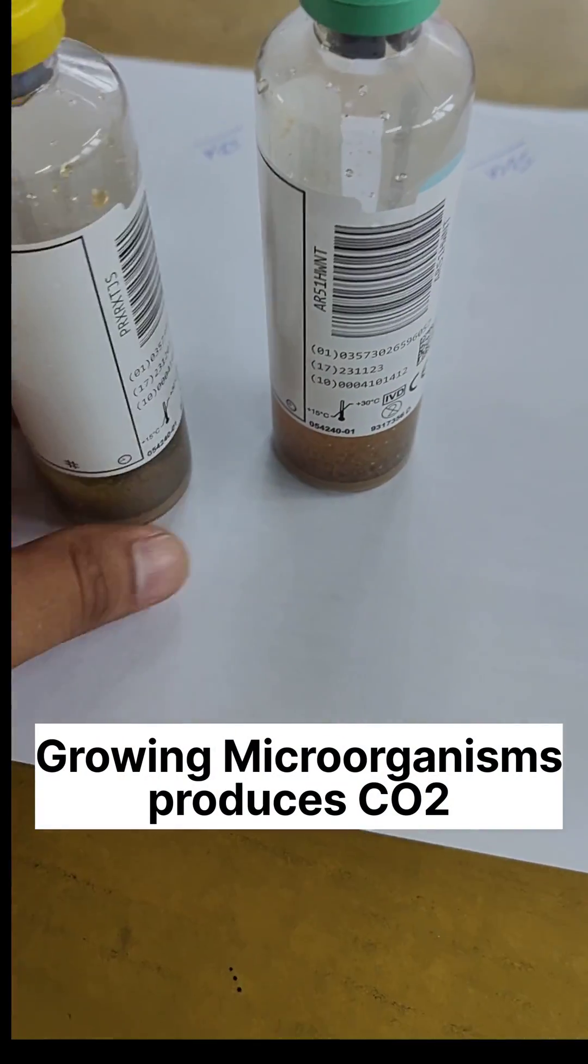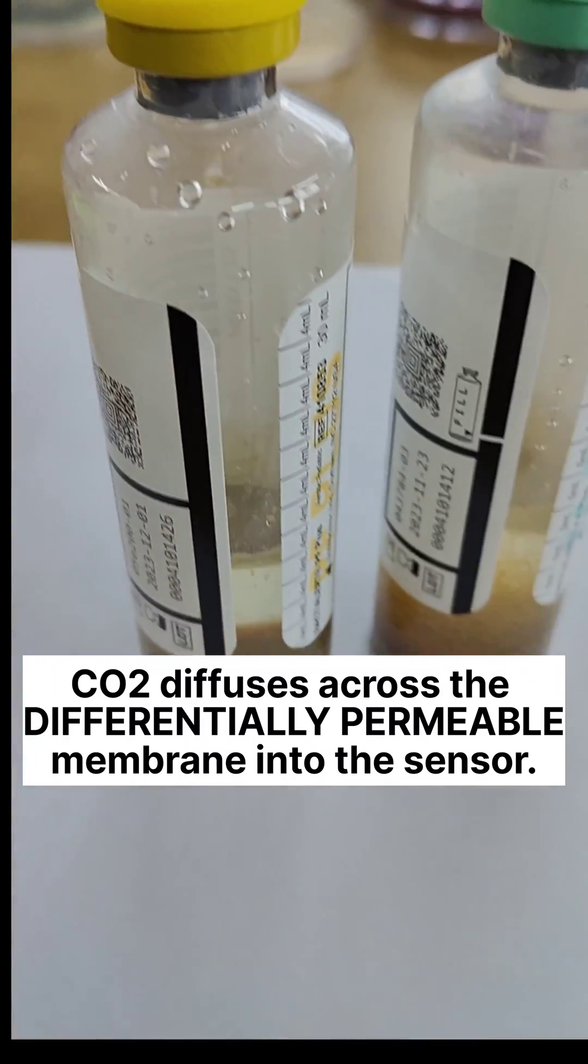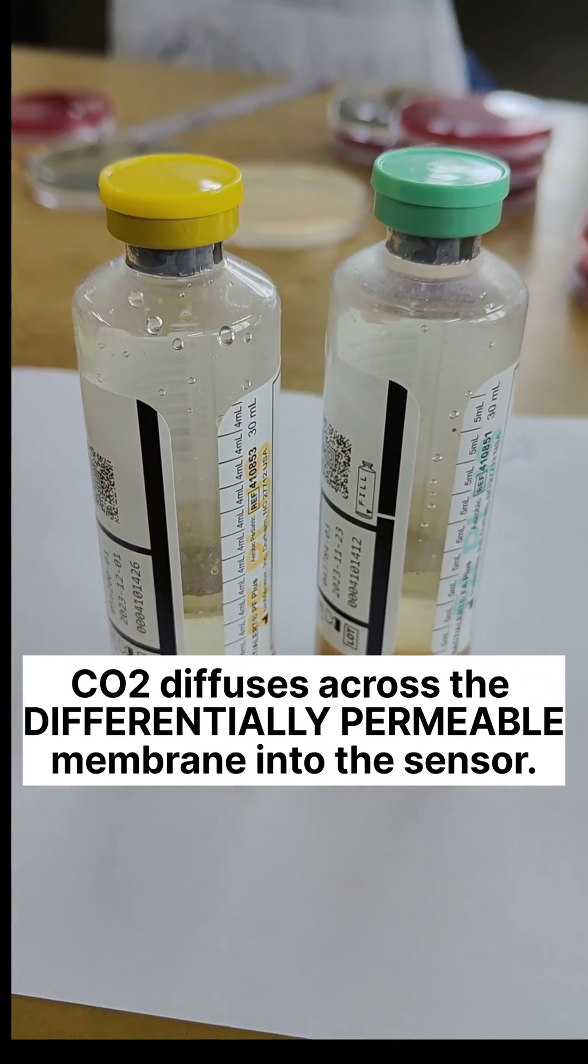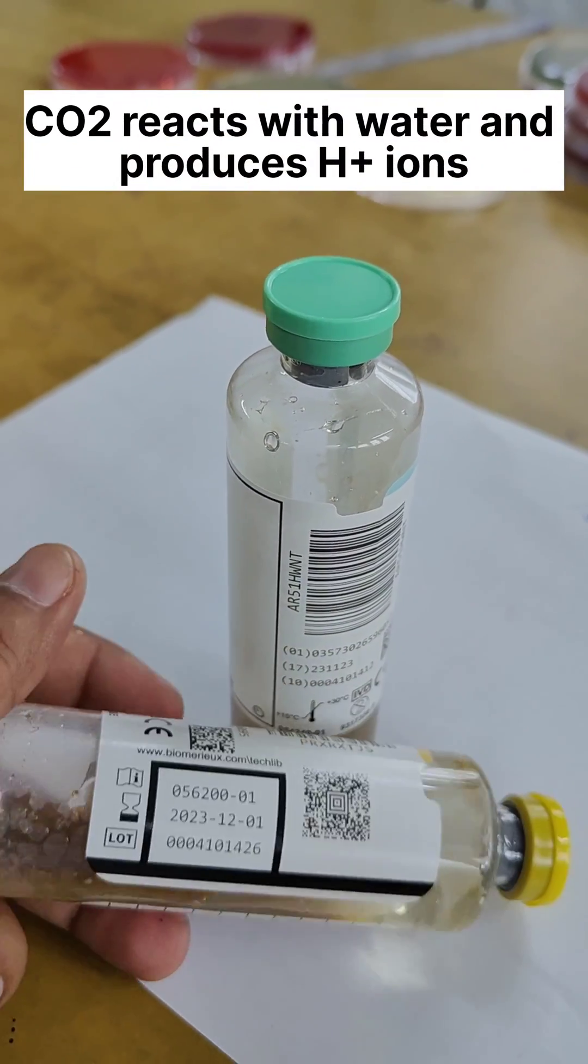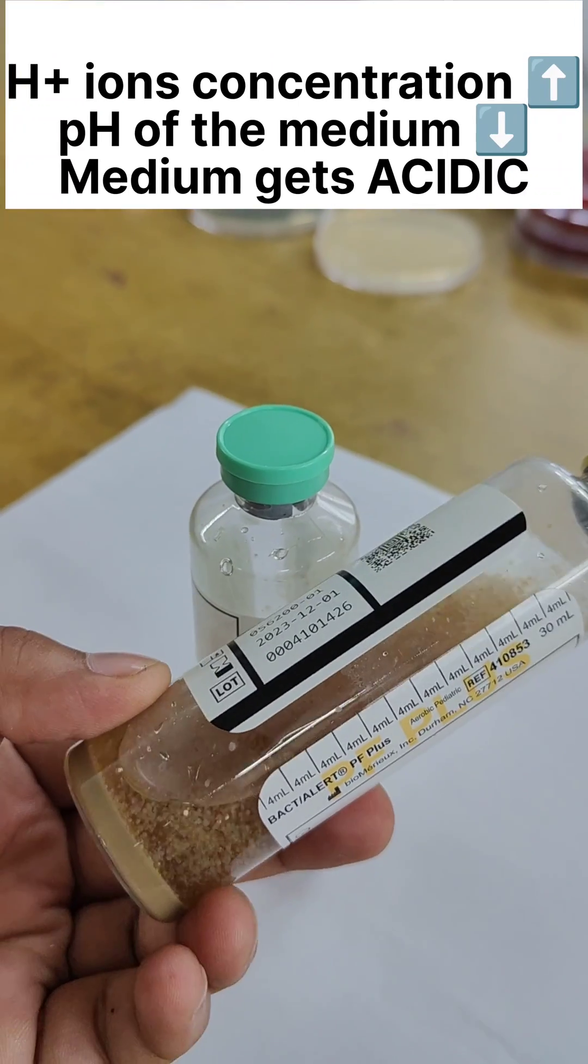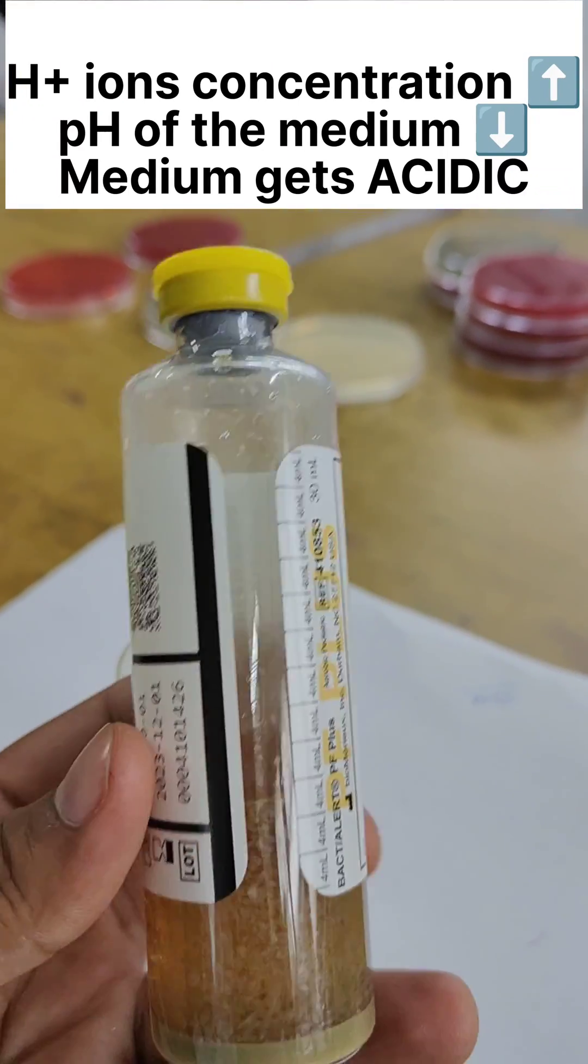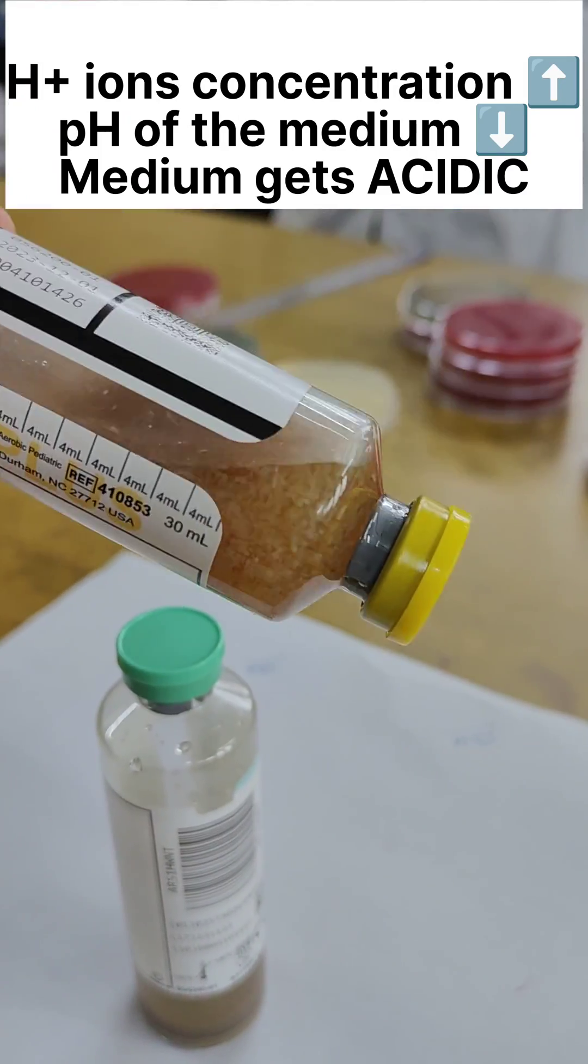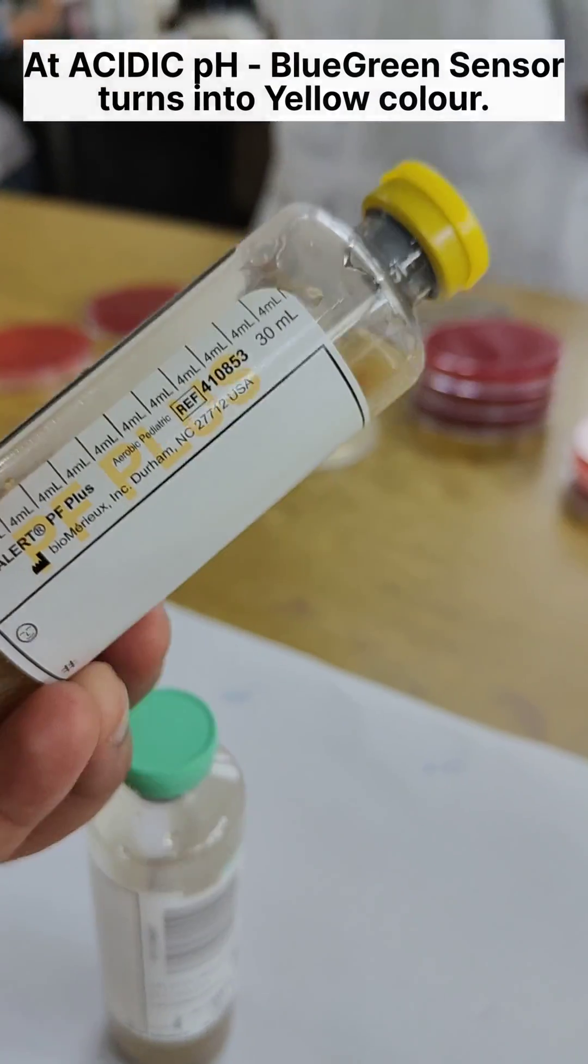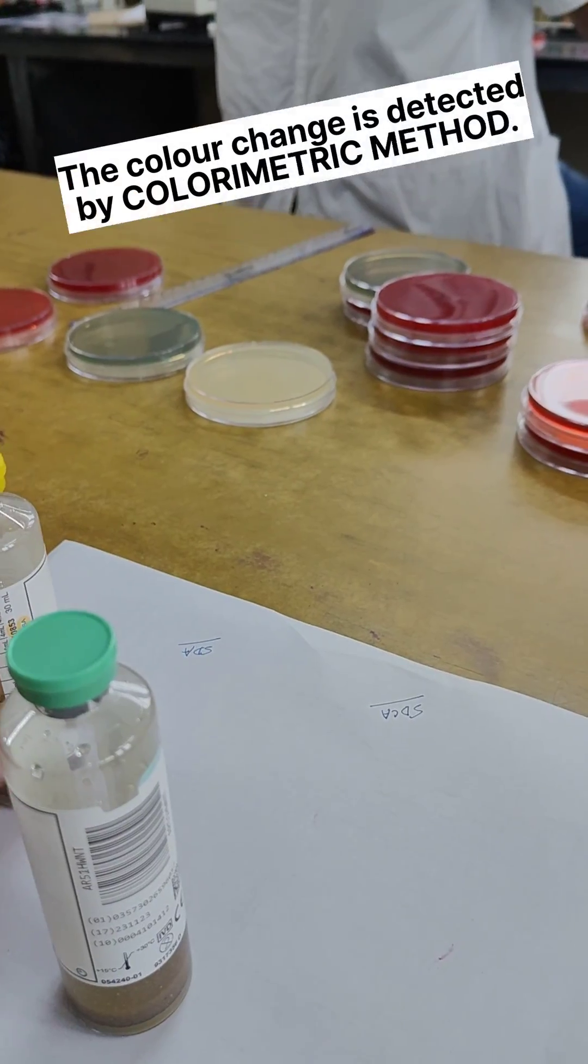Usually growing microorganisms produce carbon dioxide and this carbon dioxide diffuses across the differentially permeable membrane into the sensor where it reacts with water and generates hydrogen ions. As the hydrogen ion concentration increases, the pH of the medium decreases. Thus the medium becomes acidic and this acidic pH causes the blue-green sensor to turn yellow, and that change is detected by colorimetric method.